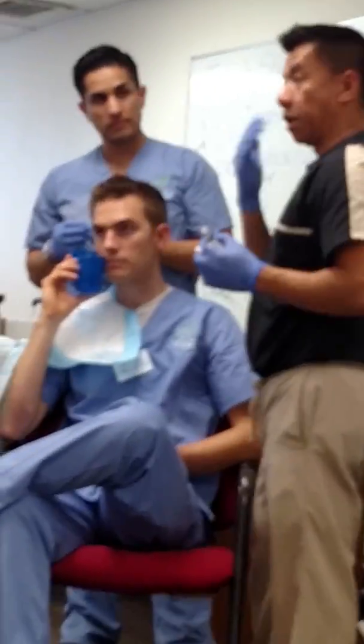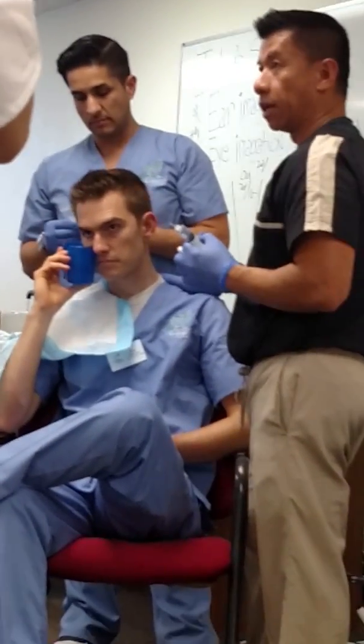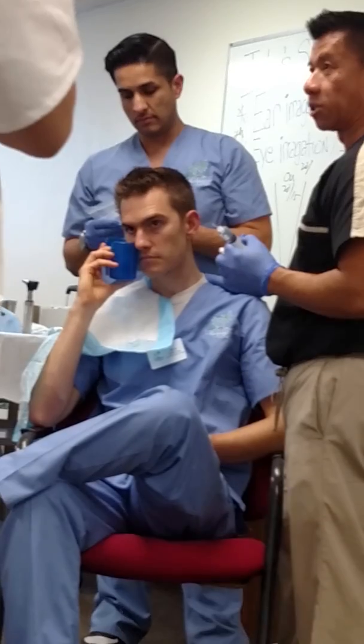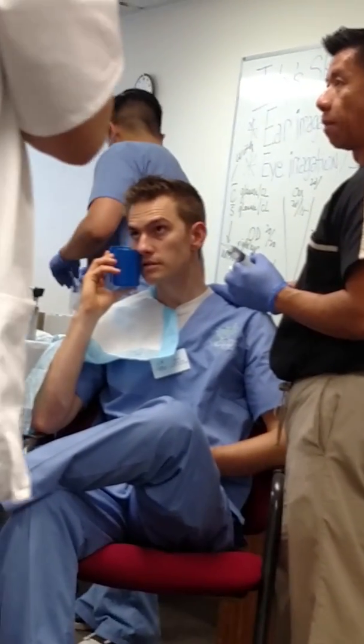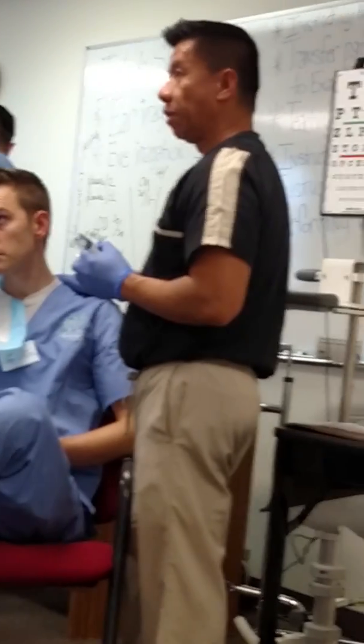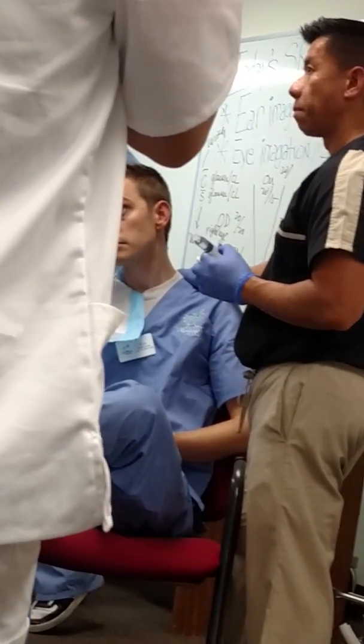Something like, the doctor said the patient was washing or cleaning the exam room, and all of a sudden some chemicals passed into the eye, or any foreign body that you want to dislodge. They can do that too, but this is the proper way of irrigating the eye. So we get to practice with Eric, all of us? Yes.